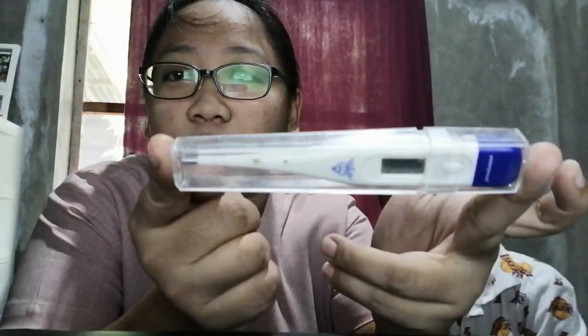Hello everyone. Today's video I will show you how to measure temperature using a digital thermometer. So let's start. I have here my son to demonstrate how to use the digital thermometer.